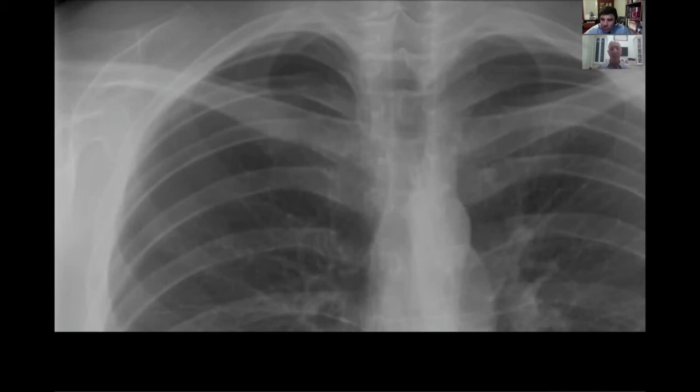I'm glad you brought that point up. And it's particularly important for x-rays, right? So the resolution that you get on your monitor is much more important in x-ray than it is for CT or MRI or the other modalities. And for x-ray, it's recommended you have at least a 4K monitor. And New York State and New York City is the only state in the nation right now that actually has a requirement, and they enforce it pretty strictly.